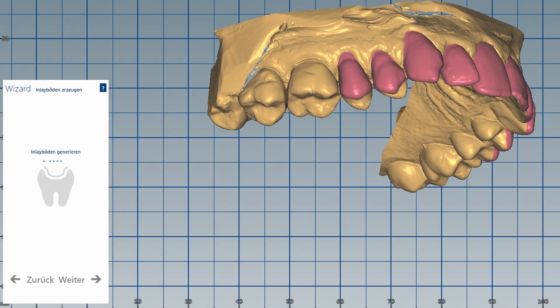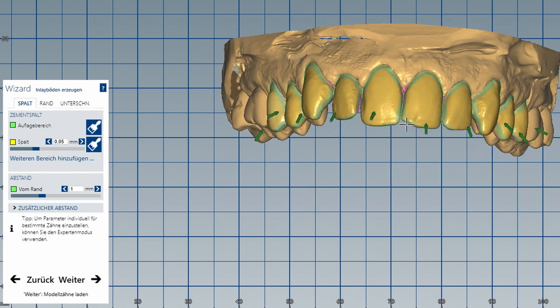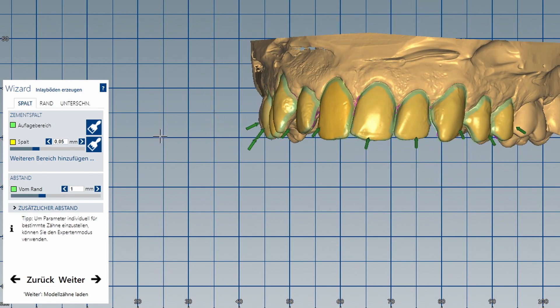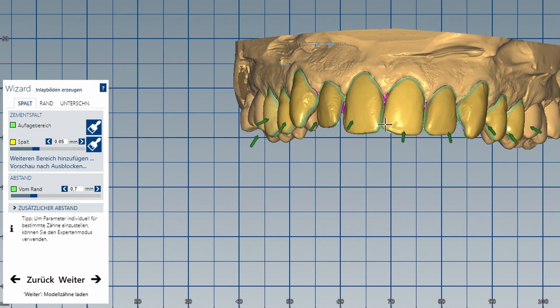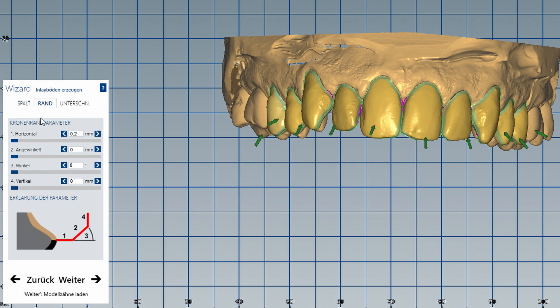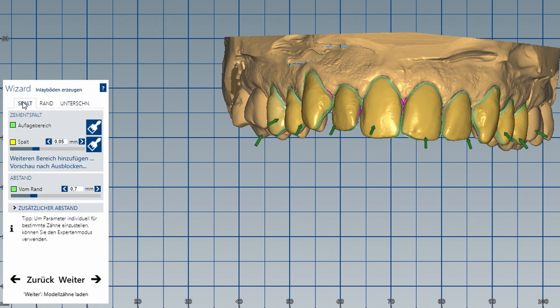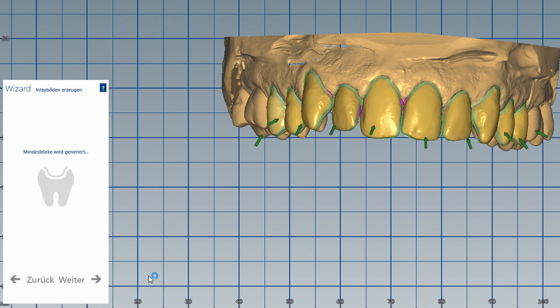After I have determined the limit, I set the respective direction and try to avoid undercuts. As a cement gap, I choose 0.05 mm to ensure enough space for bonding with composite. I reduce the area around the edge from 1 mm to 0.5 mm. For the perfect finish, it is advisable to pay attention to a level of 1 mm during the preparation. But even with leaking edges like in this example, we achieve very good results with our Edelweiss block.